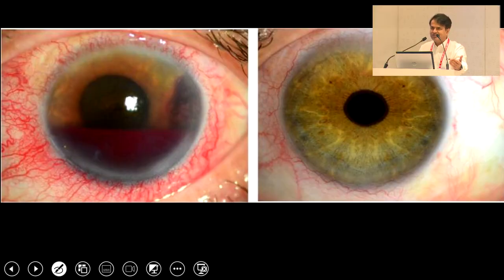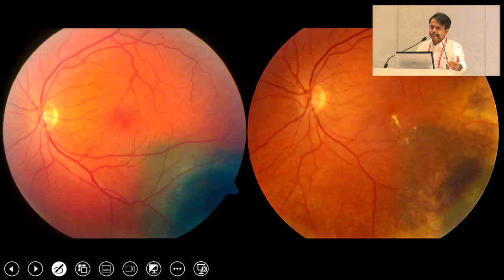Vishal is familiar with this patient. This patient presented with ciliary body melanoma with iris extension with hyphema, and following plaque brachytherapy, the tumor completely went away. That means that it was a poorly differentiated tumor. That happens only in poorly differentiated tumors. Otherwise, these are the typical outcomes. That's a choroidal melanoma treated with brachytherapy. You can see some effects of radiation retinopathy right in there.